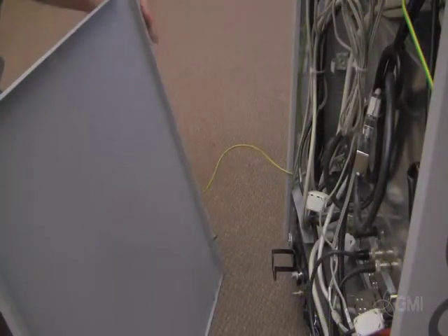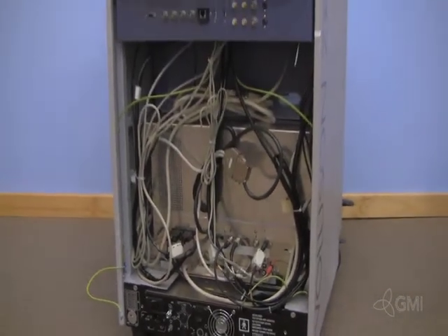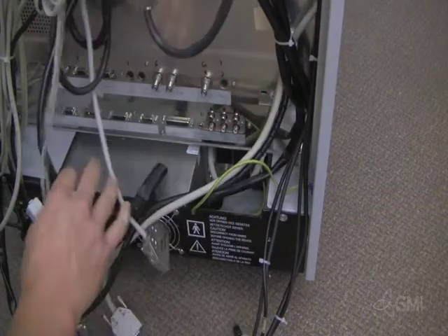Disconnect the ground cable from the rear panel. Unplug all power cables from the main power supply.